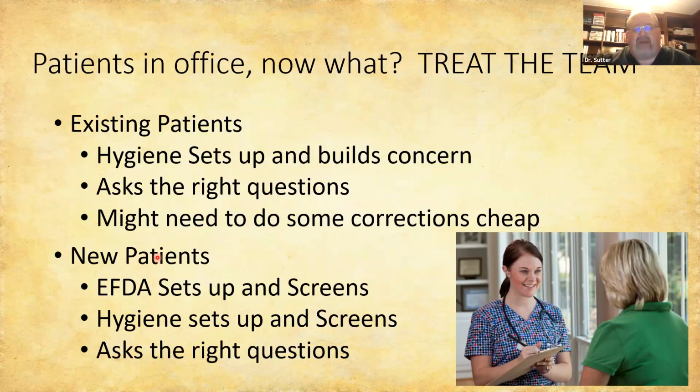So just have a small handful of questions to ask the patient, and then you can segue right into, all right, as part of your new patient experience, I'm not really concerned with your probe depths. Everything's like a 3 or a 4. I think we could tighten that up a bit and get all 2s and 3s. My hygienist is going to show you how to do that.